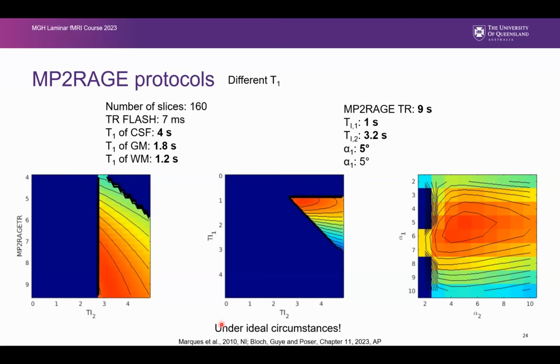If you're not getting full transmit power. I mean, as I said, he's not fiddling a lot with it. I know John fiddles a lot with it. So it depends, but you have your own coil, so that's quite different. But obviously these parts need a lot of power. So what I'm trying to say is this is not easy either. So if you want to change it, put in enough resources to make sure it still works. If it works for you, don't fiddle with it.